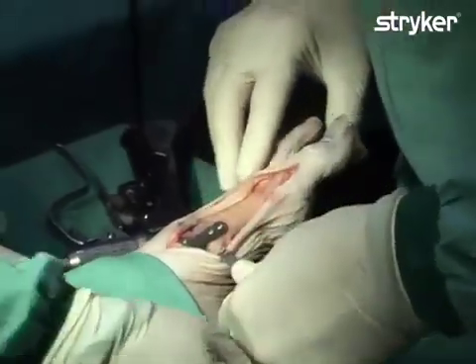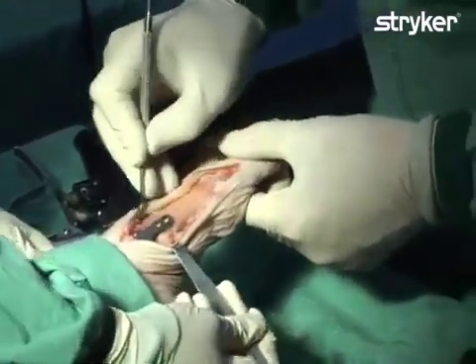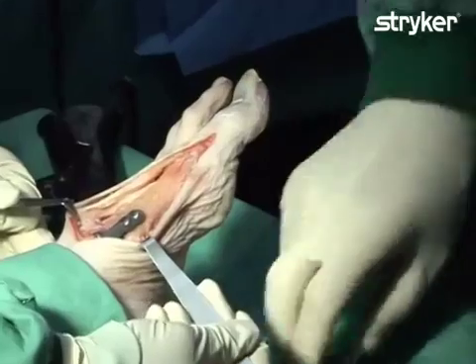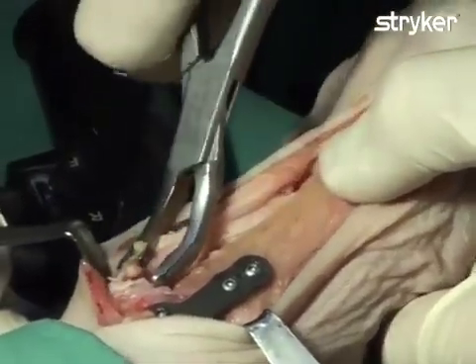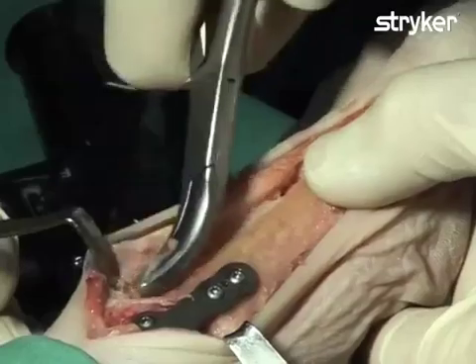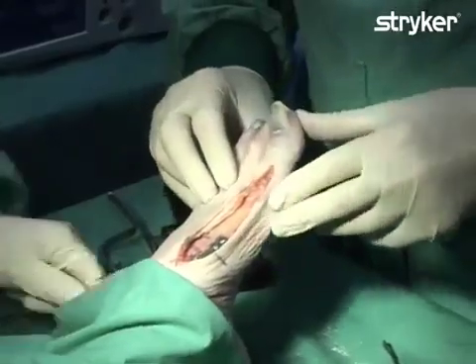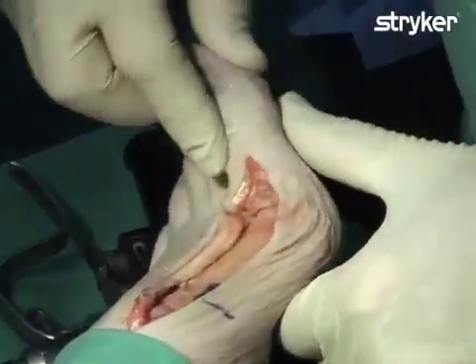The fusion site is now re-examined and complete closure of the fusion site is reconfirmed. The bony step-off created by the plantar positioning of the metatarsal is illustrated and then removed to smooth the edges of the fused joint. The retractors are then removed and the position of the first ray is verified. Free range of motion is confirmed. In conclusion, the osteotomy or fusion site does not move at all and the big toe is straight.